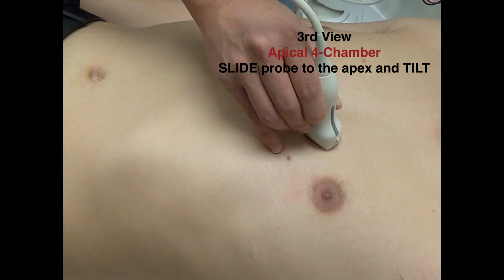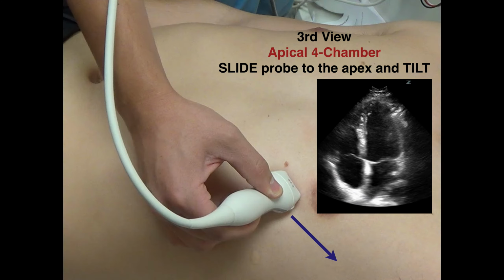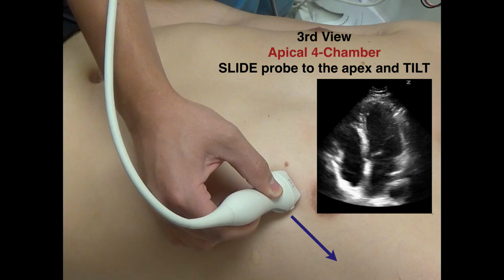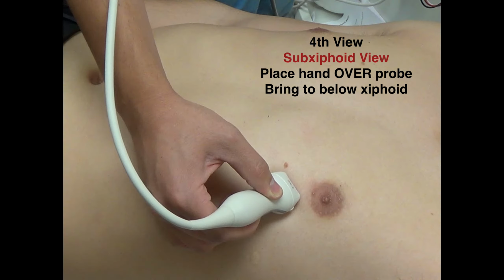Now you're going to slide your probe as you see the circle getting smaller and smaller as you go down the cone, and eventually you're going to tilt on that apex. And this is what it looks like. You see I'm sliding the probe down, circles get smaller, and then I tilt on it right when I don't see any more cardiac motion, because I know I'm past the apex, and this is what the apical four-chamber should look like. Once again, the indicator is still towards the patient's left side.